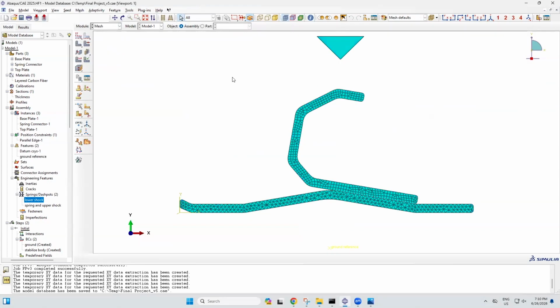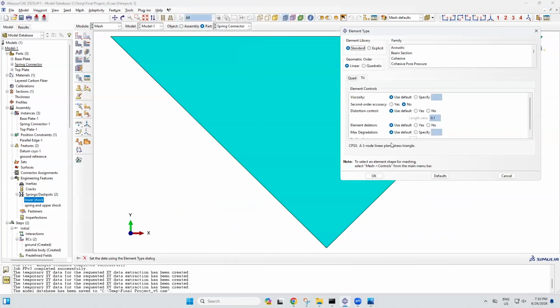Next, I went to the mesh controls, and I used 3 different types of meshes. For the spring connector, I used CPS3 elements or linear triangular. These are very stiff elements, but because it is one part and is only moved down, I used a singular element to represent overall deformation.